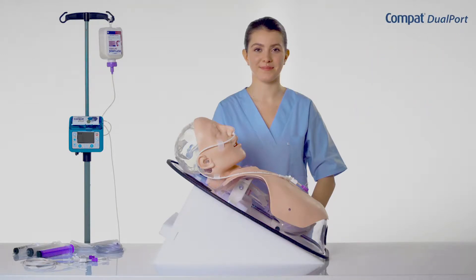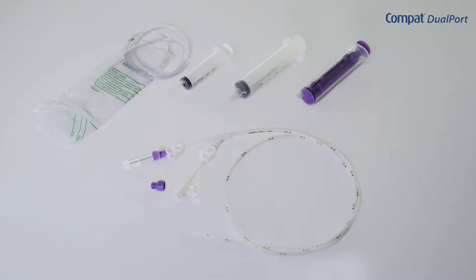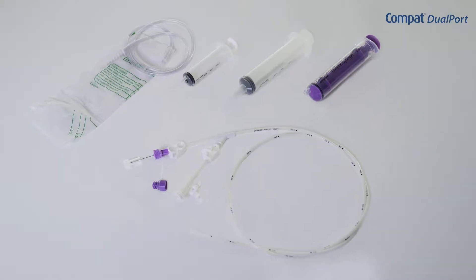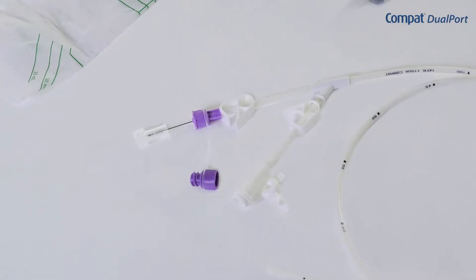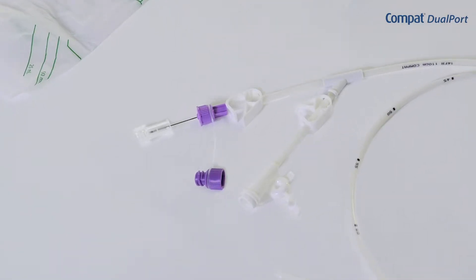During this training video we will learn how to use Compact Dualport, a dualport nasogastric tube that helps to simplify the administration of enteral feeding as well as gastric drainage by the use of one tube for both operations.